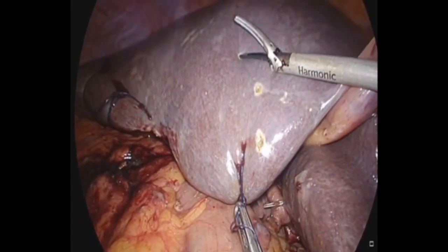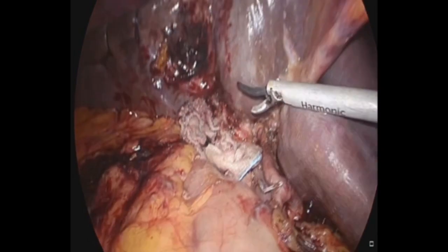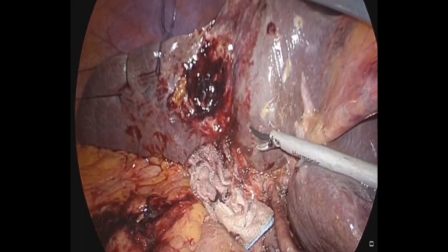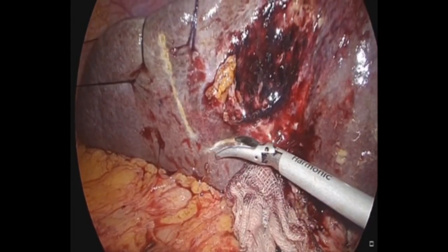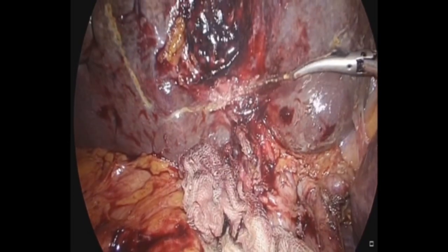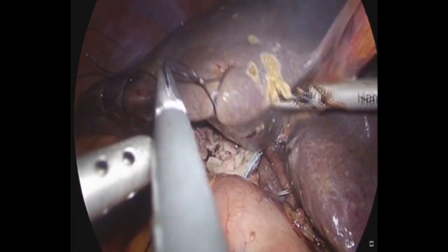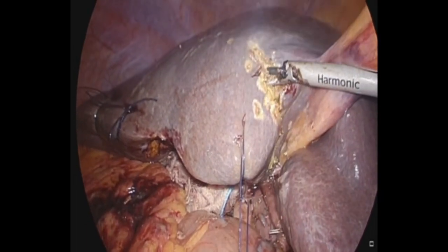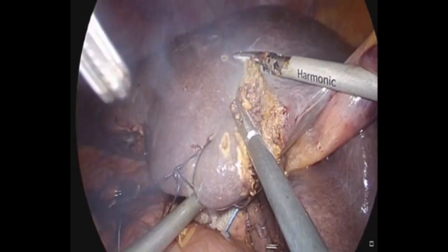The scoring of the liver surface is done with the Harmonic HD 1000i, making sure we are two centimeters away from the gallbladder fossa from which the gallbladder had been previously removed. When going posteriorly, the endeavor is to remain quite high up from the Rouviere's sulcus so as not to cause any injury to the ductal and vascular structures there. The trick of liver resection with harmonic alone is to remain perpendicular to the liver surface and not come closer than two centimeters to the gallbladder fossa.